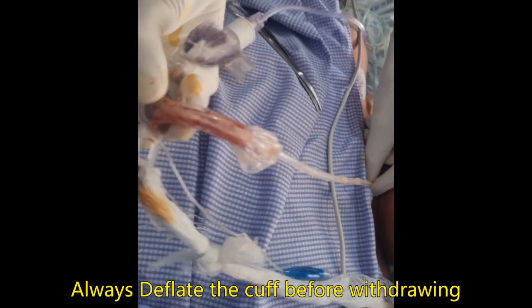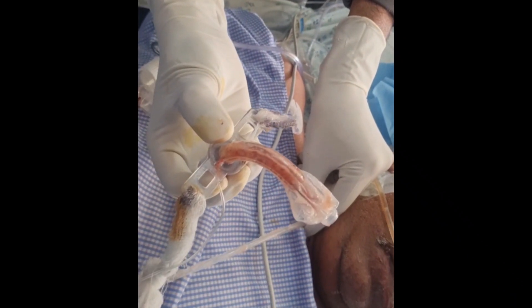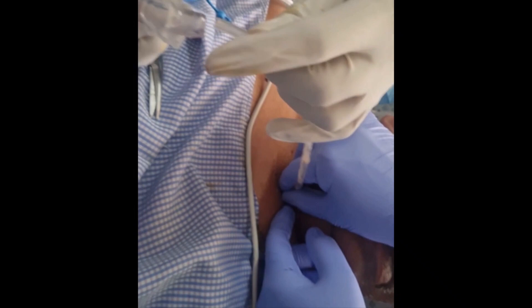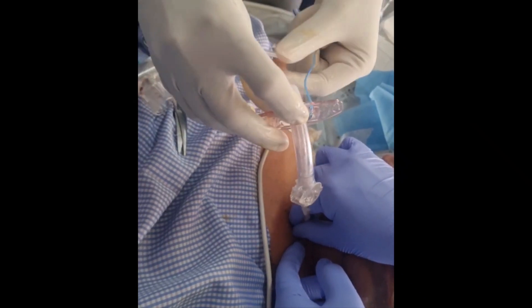Keeping the suction canula inside, we can see the old tube has a lot of blood clot — it was the correct time to change the tube. Keeping the suction canula inside, the assistant holds the canula and we insert the new tube over it.